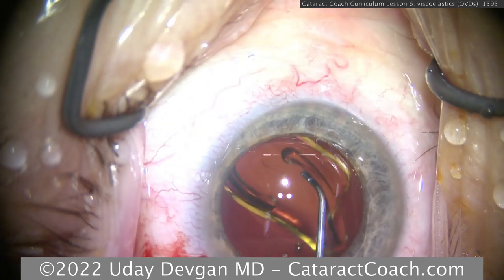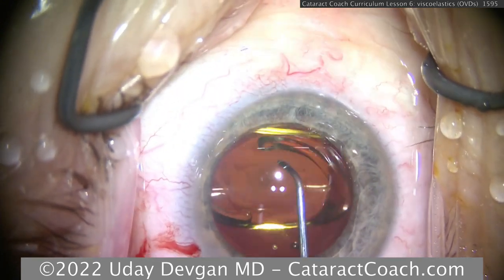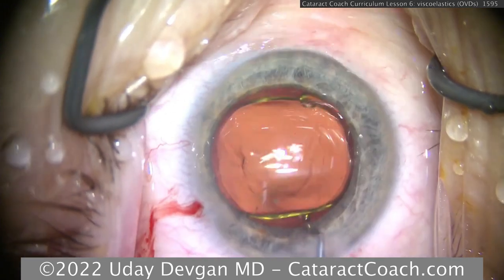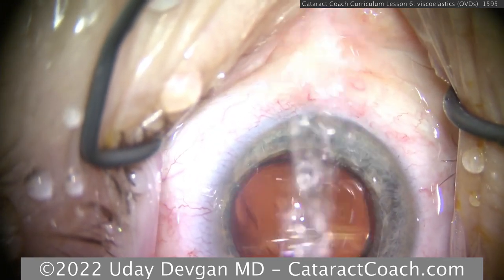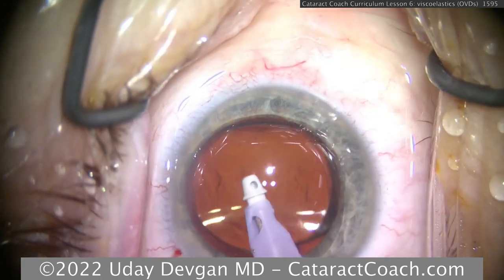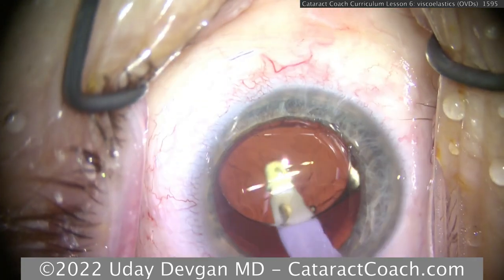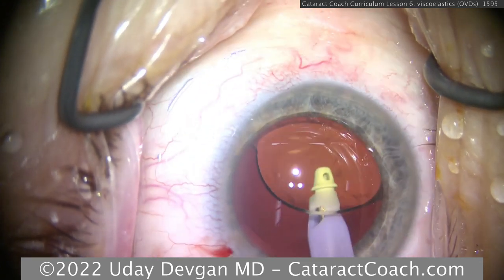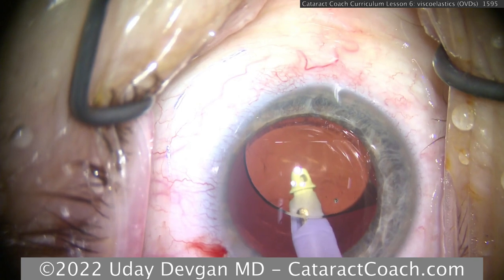The anterior and posterior capsule are separated from each other. The bag is deep, as well as the AC being deep. Lens is in good position here now. We'll take the IA probe, go underneath the IOL, remove that viscoelastic, and then remove the viscoelastic from in front of the IOL. Now behind the IOL is all cohesive, so it comes out very quickly, very easily.